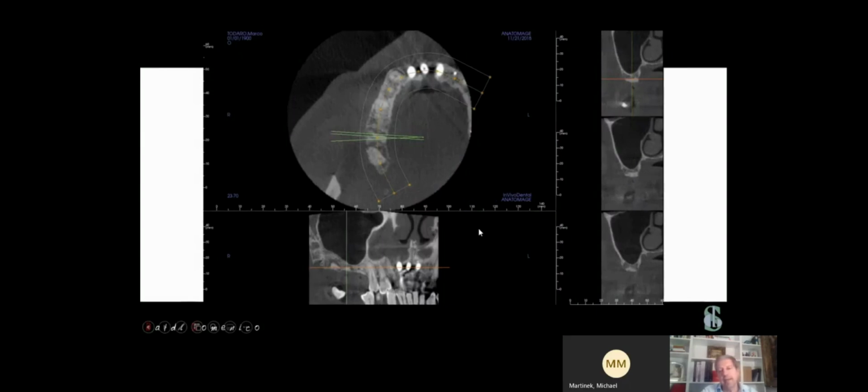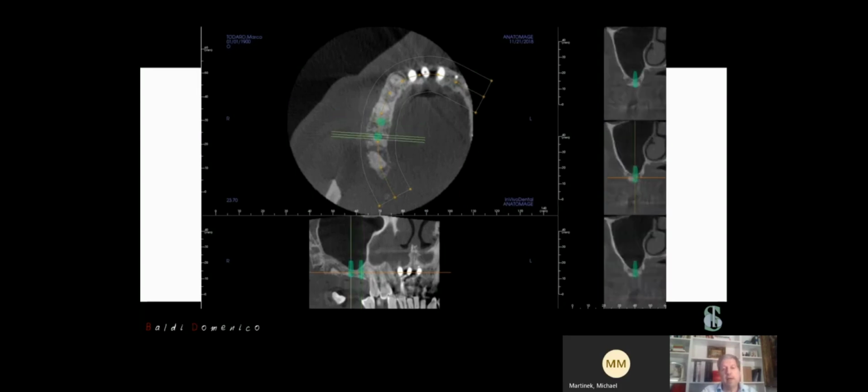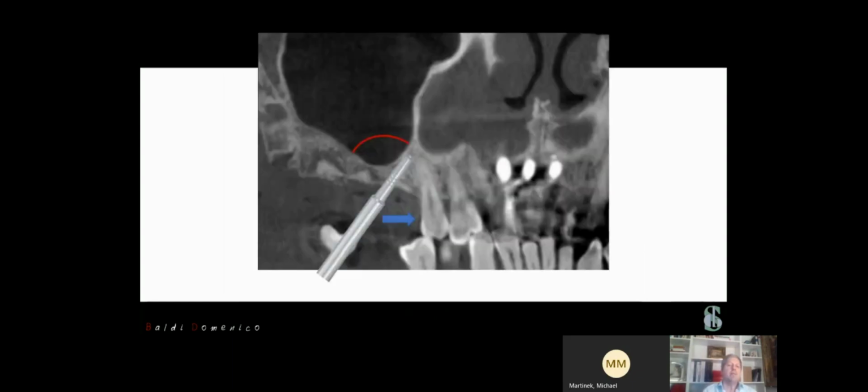So we decided to make a crestal approach using the magnetic mallet. Here you can see how we planned our surgery, and here of course it is necessary to place two implants and at the same time to have a sinus lift. And this is how we worked with the magnetic mallet.